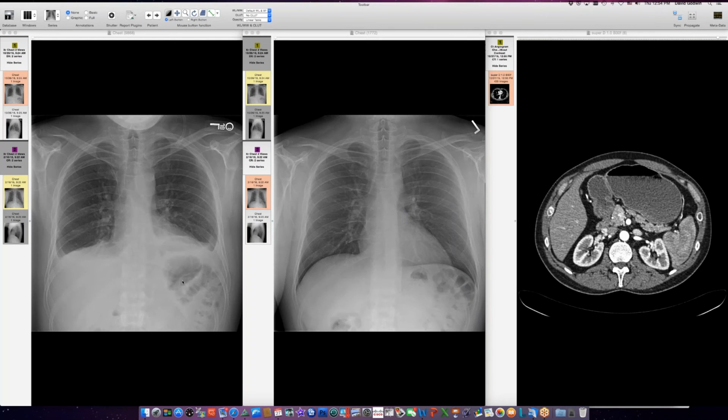Okay, so this is a fellow who had a bone marrow transplant and has graft versus host disease. He had myelodysplasia, and he previously had aplastic anemia. This is his current radiograph. He's got some respiratory distress. He cannot lie flat. He does have some small pleural effusions. He's got very low lung volume and some basal atelectasis, and he's been looking like this for several weeks. This is a previous radiograph before he had these problems, and you can see he had much more normal lung volume at this point.